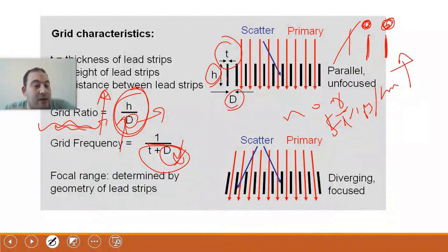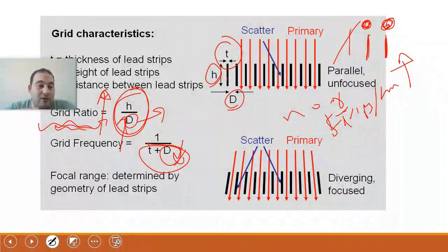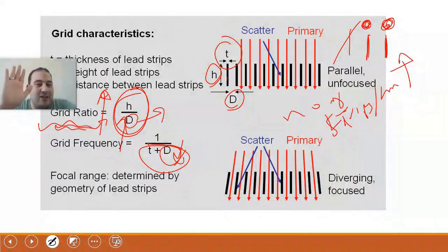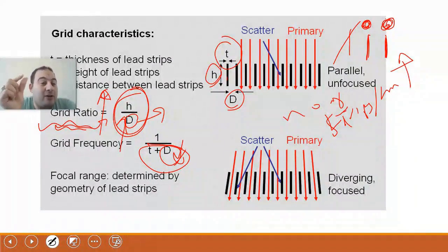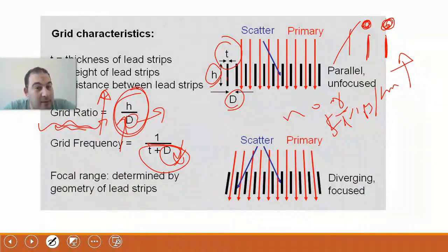Okay, will the number of gaps increase or decrease? If I increase the number of strips, the number of gaps will increase. Great. The number of gaps will increase, meaning each gap will be responsible for a specific object, right? Right, that's correct.